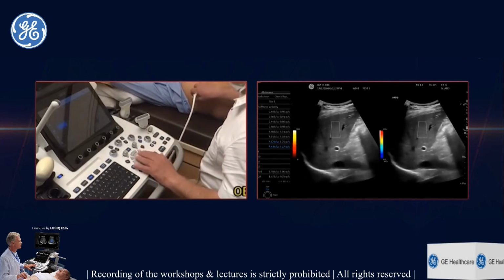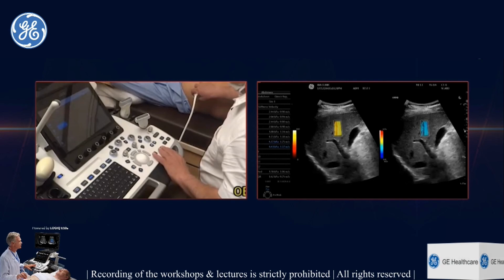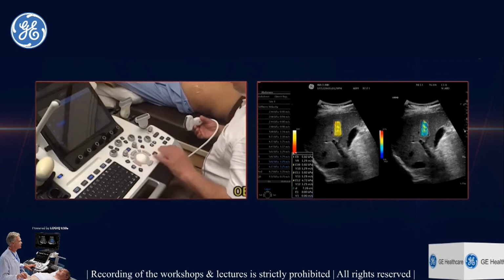So we'll take some more. And again, that seems to be a good map, and you can see that it's of uniform yellow, green and yellow, the ROI, the quantification. And again, all measurements seem to be coming in the normal range. So we've taken about 8 measurements.